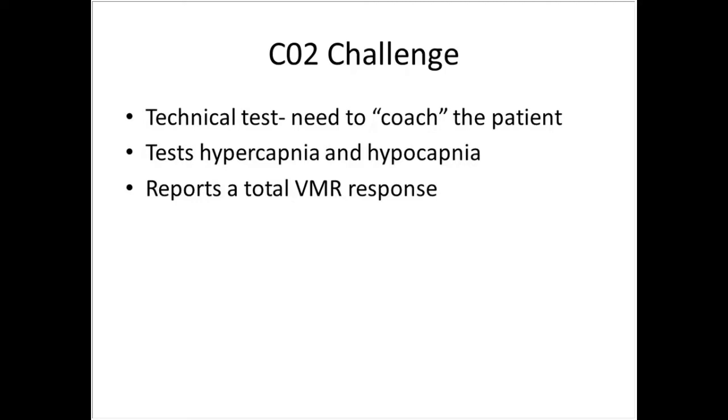So we always tell our patients you're getting plenty of oxygen. It's actually a higher percentage than what we breathe in the atmosphere. But the brain will compensate, and they start to breathe a little quicker and they start to hyperventilate. So the CO2 test will test hypercapnia and hypocapnia, and it does report a total VMR response.